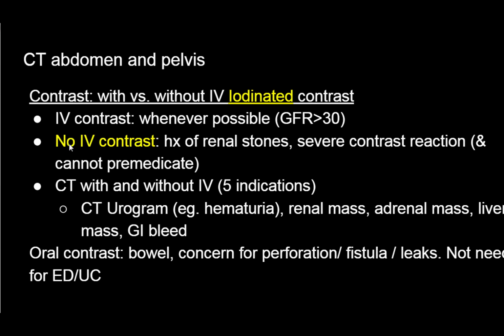We typically don't give IV contrast for patients who are presenting with suspicion for renal stone in a person with a history of renal stone. If they do not have a history of renal stone and they're presenting with flank pain, then you want to get a routine abdomen and pelvis with IV contrast because there are other causes of flank pain.